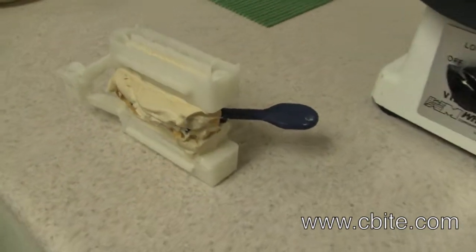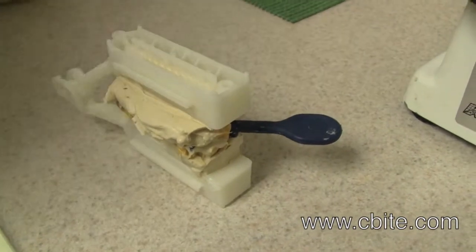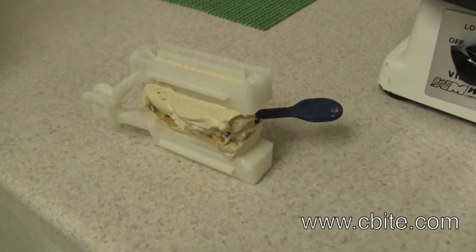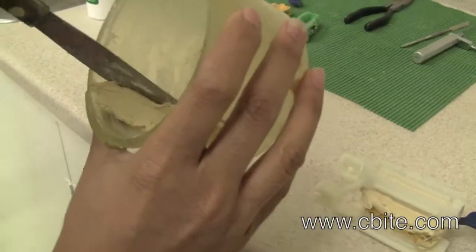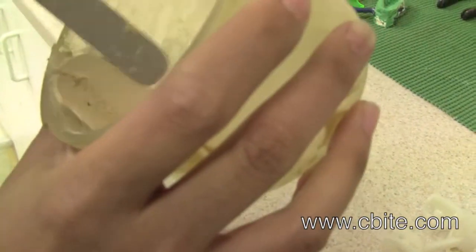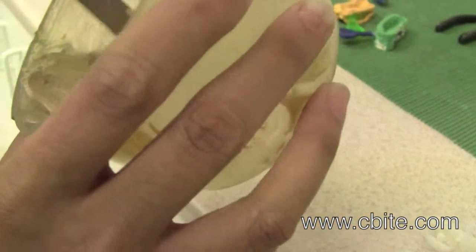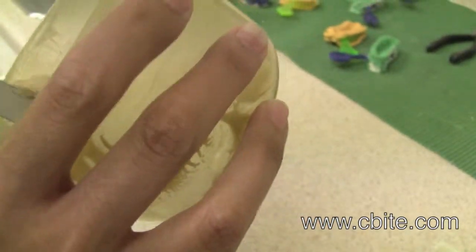Not only will it be functional, but it's also going to look nice. To get the right consistency, make sure it has a clay-type, doughy consistency.